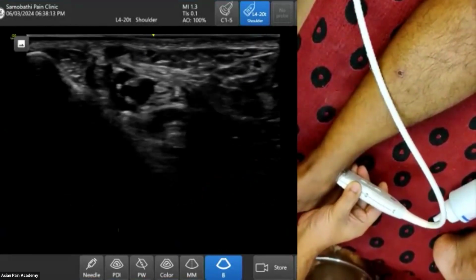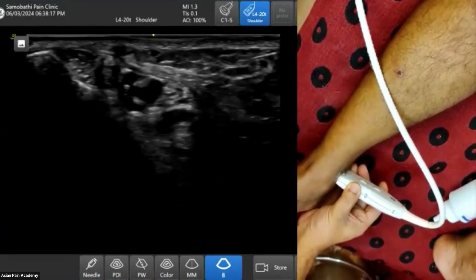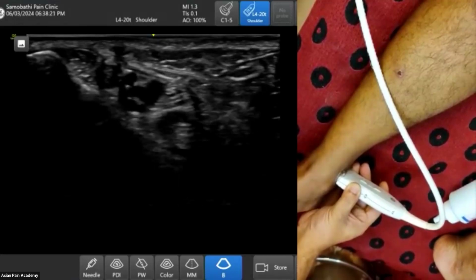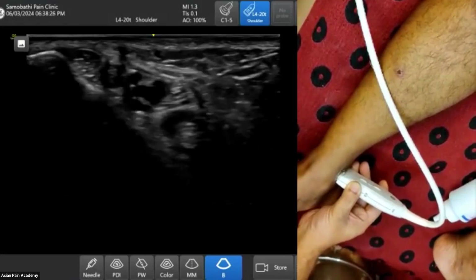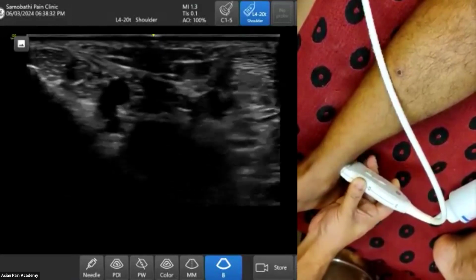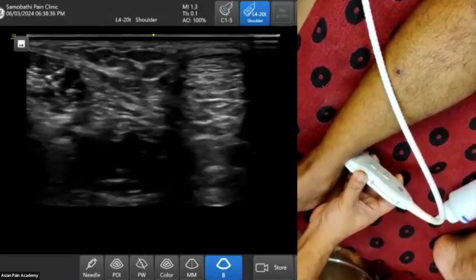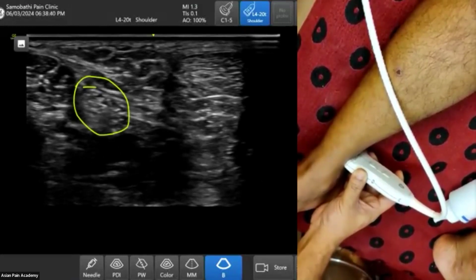First tendon, second tendon, there is neurovascular bundle, and below that there is the third tendon. That third tendon is also with muscle a bit. So you can see the neurovascular bundle. If I go up, then all the vessels will become one, and the nerve will become much bigger. This is the big round nerve.